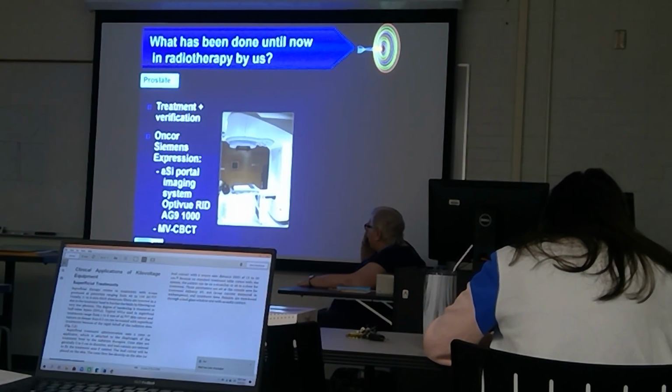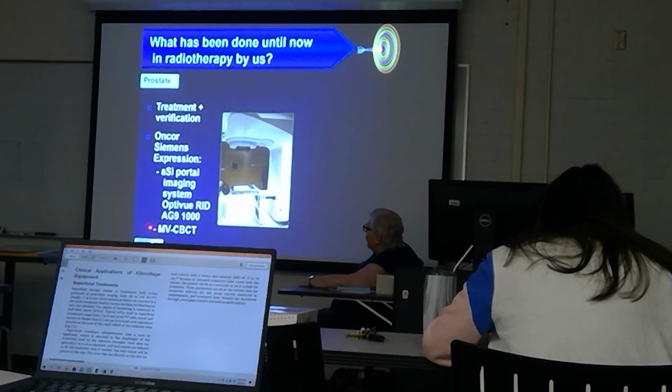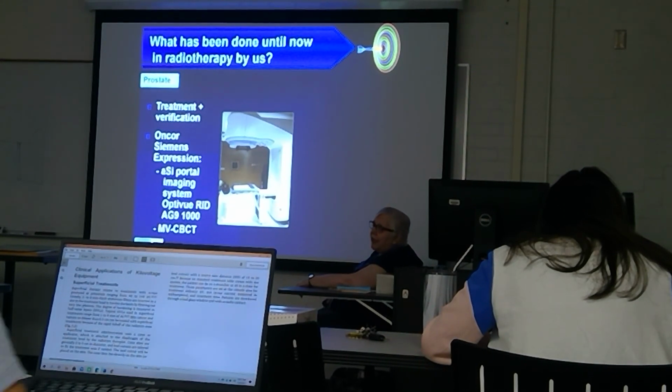The Siemens machine uses an MV CBCT rather than a KV CBCT.